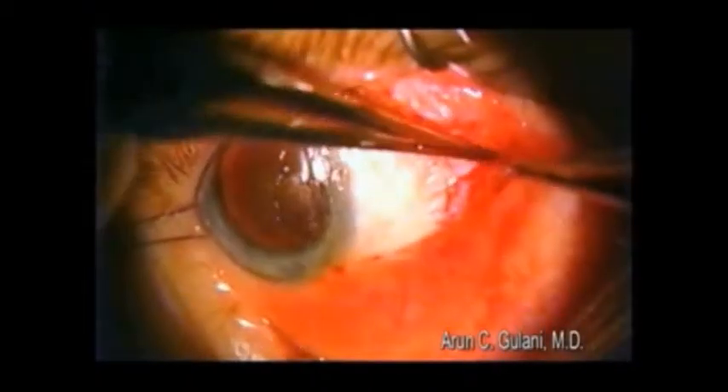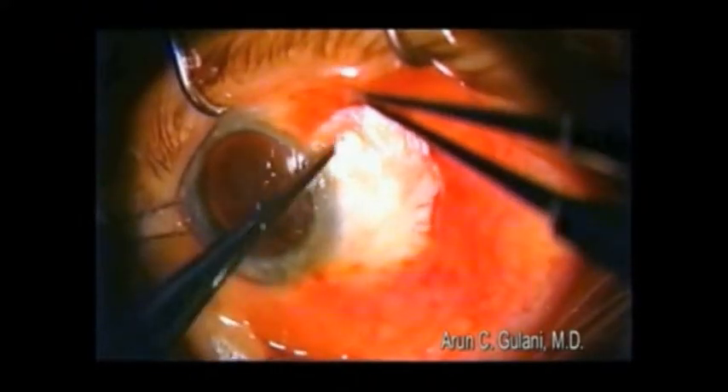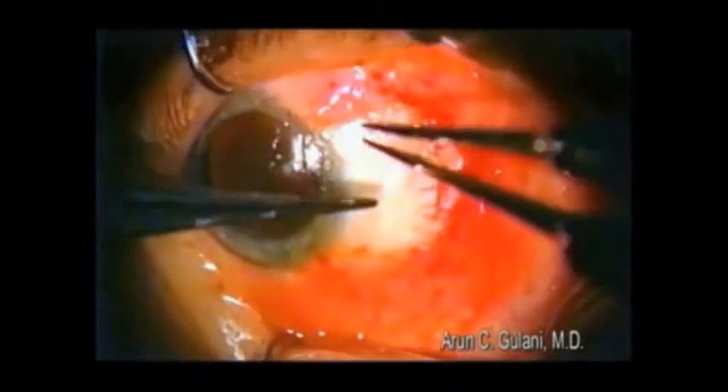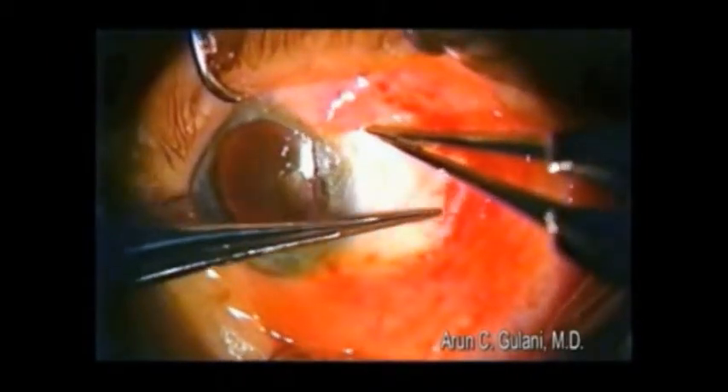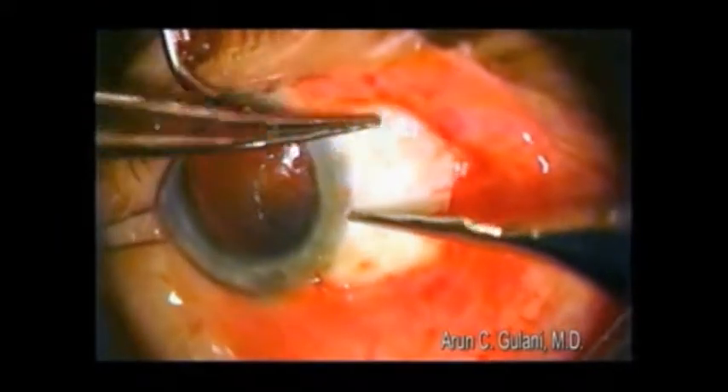Accept the amniotic membrane epithelial side up, tuck it under the surface of the pterygium.